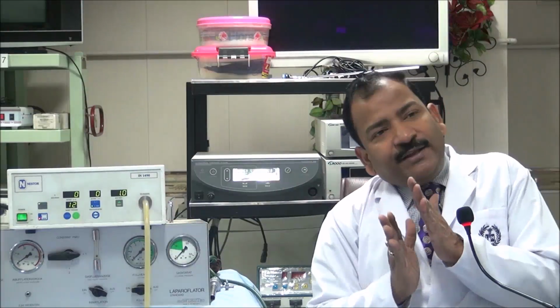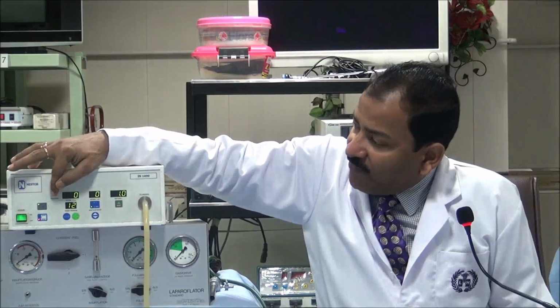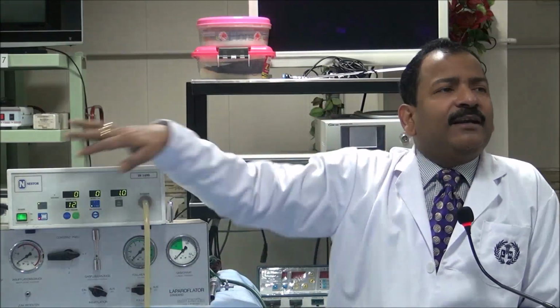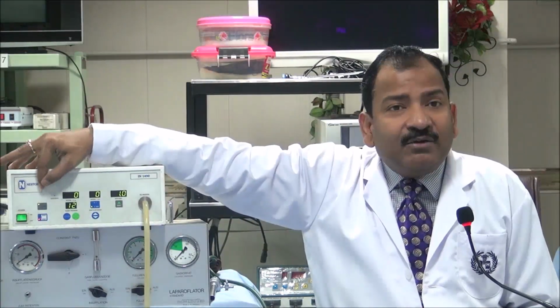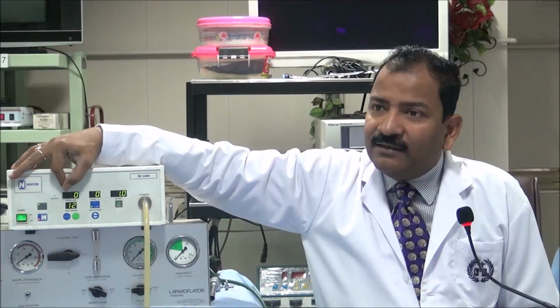But from the beginning your graph is going parallel. This is the actual pressure, and this is the total amount of gas used. So this graph of the actual pressure and total amount of gas used will let you know within 5 seconds where the gas is going. If I am going to the correct place, there is a slow rise in the actual pressure and a slow rise in the total amount of gas used. If I am going pre-peritoneum, within 200 to 300 ml it will become 12. Isn't it?